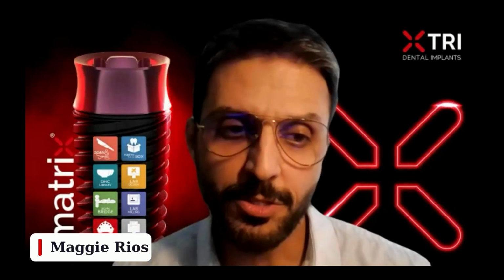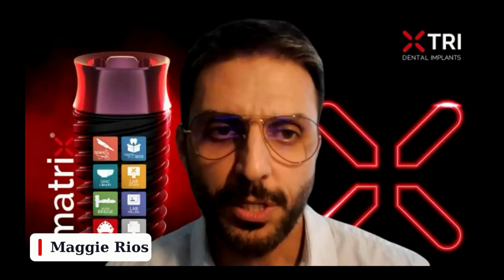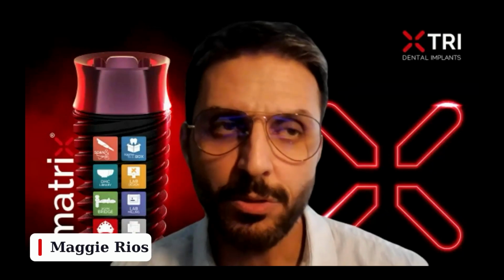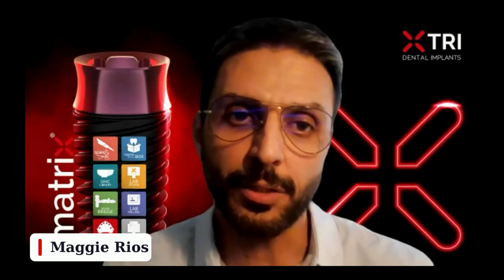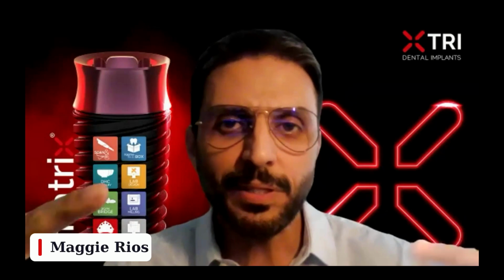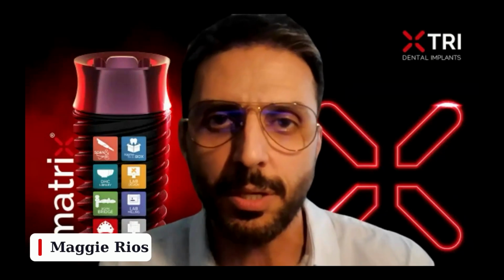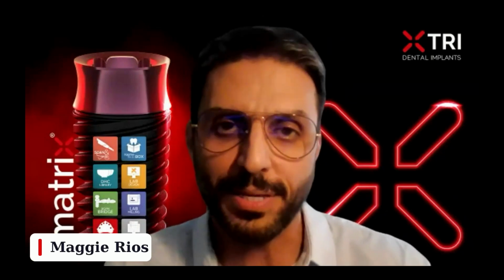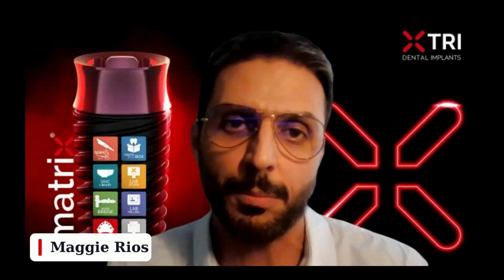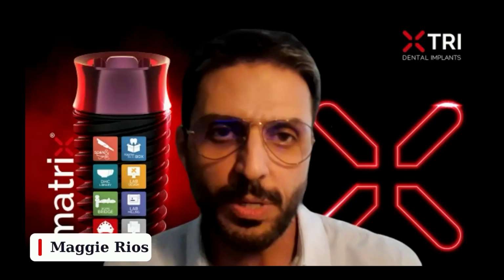Yeah, absolutely. Thanks, Dr. Dunlop. I want to add just a note here to what Dr. Dunlop explained. When you have different implants at different angles, even though you unscrew the screws, the screws are still inside and kind of engaged, not tightened, not in the threads, but still placed there, so it's going to prevent it from coming out altogether. So you want to make sure that you remove the screws before you take it out.